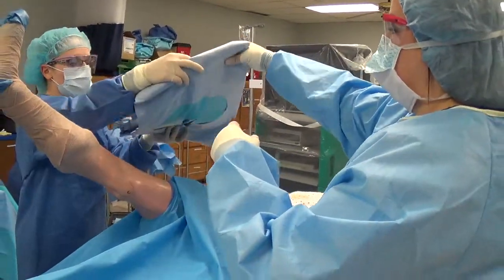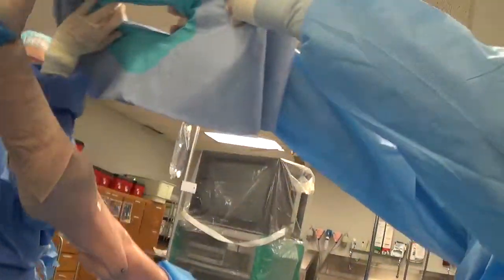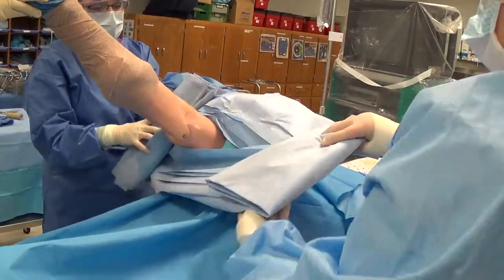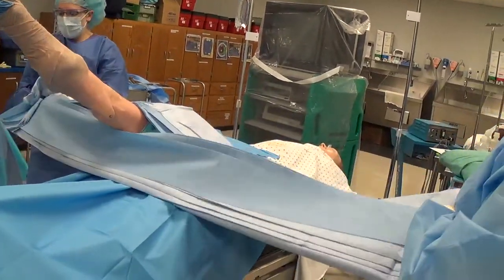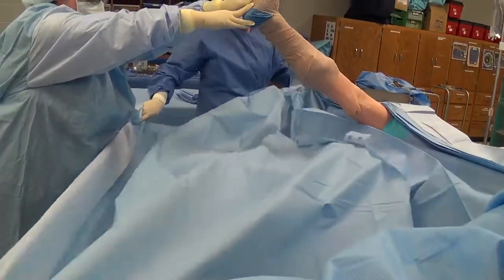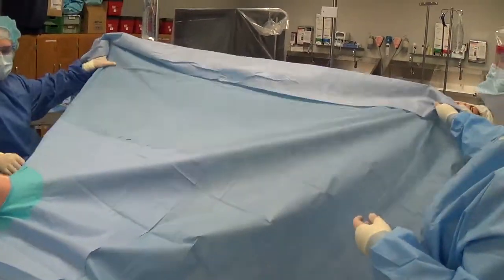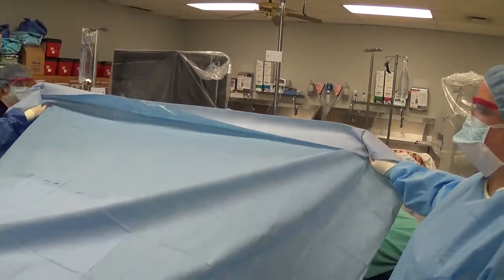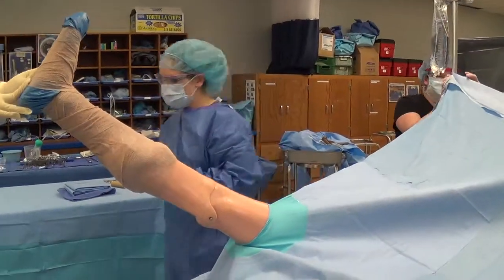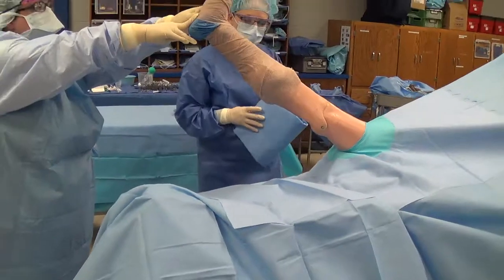When you hand this to the person you're draping with, put your hand inside the stretchy fenestration to make sure it stretches, because your patient's legs are probably going to be larger than that opening. Keep your hand in there until you get up to the impervious split sheet, then open it out just like a laparotomy sheet — grab the bottom section, cup your hand on the inside, extend out over the foot, then grab the head section, cup your hand, and extend up to anesthesia who will attach it to the IV poles. These sheets may or may not have armboard covers depending on the type of sheet being applied.